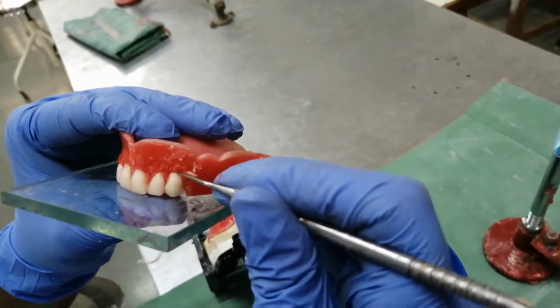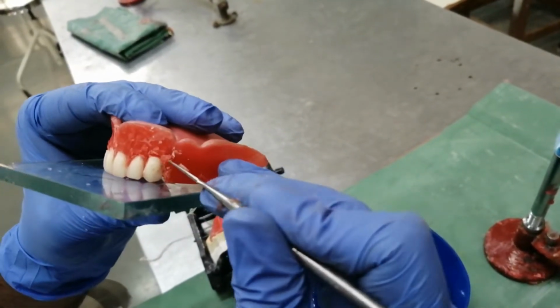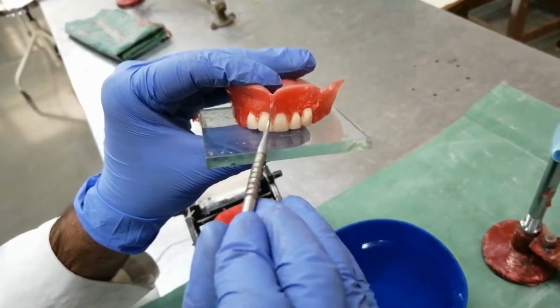Canine tips should touch the glass slab along with the incisal edges of the central incisor and remaining occlusal rim.